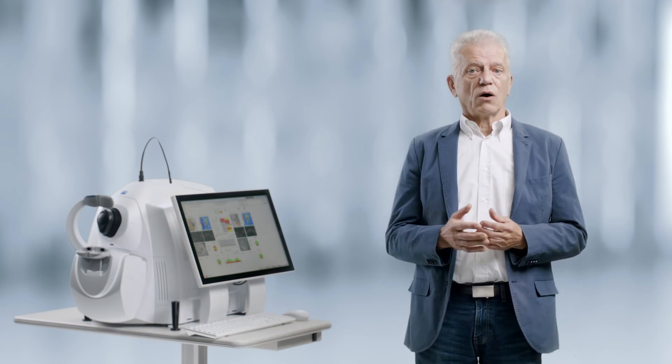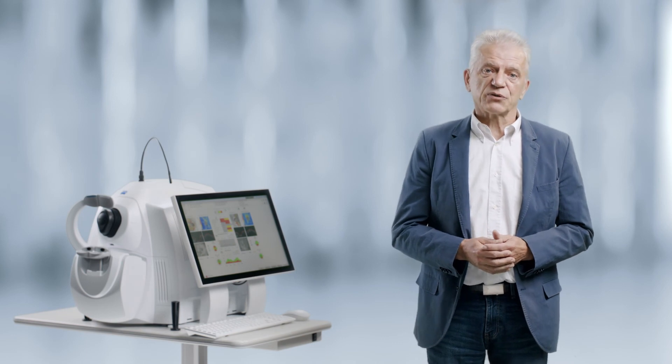This video will show you in a short form how you can acquire a cube scan for ONH assessment on the CIRRUS 6000.